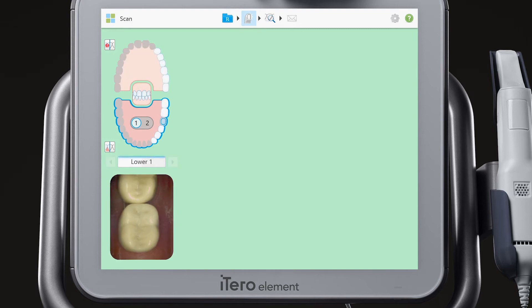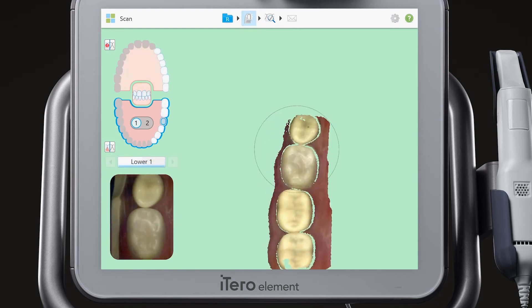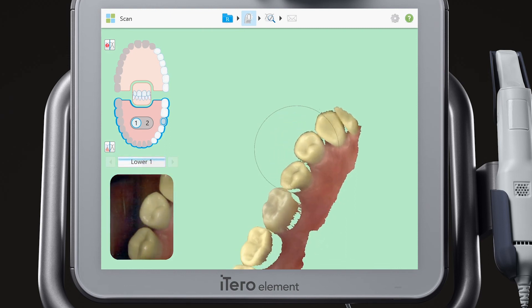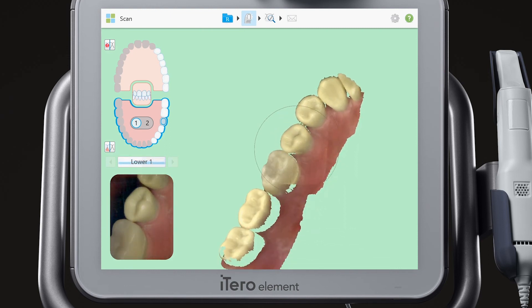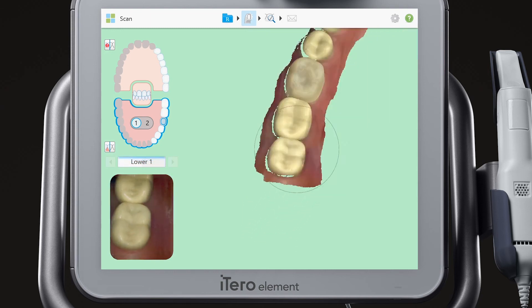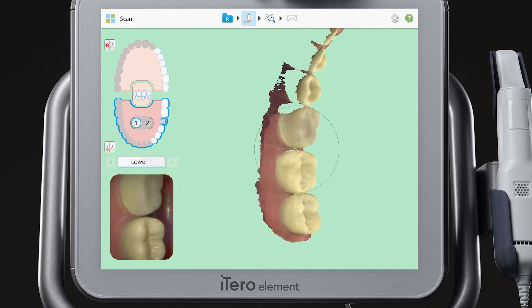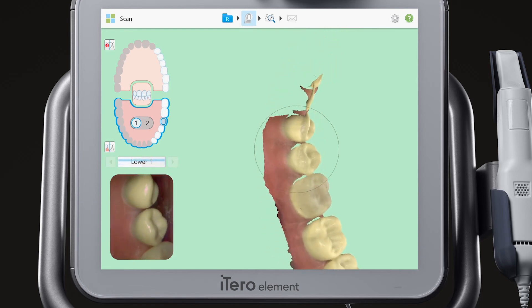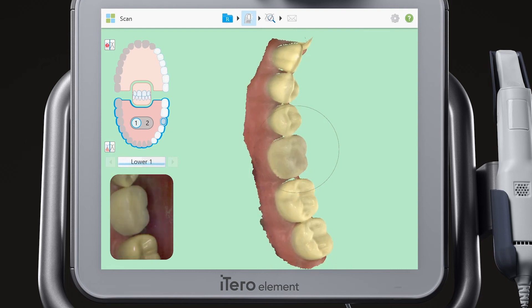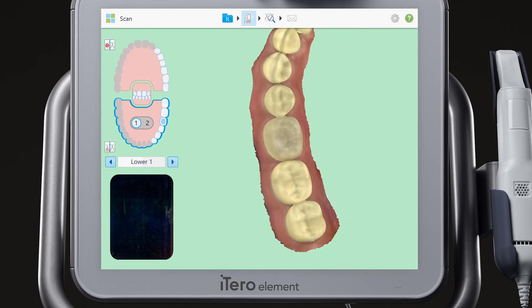Next, scan the occlusal, lingual, and buccal of the pre-treatment segment. Notice that the background on the scanner is green. This signifies that you are in the pre-treatment scanning segment.